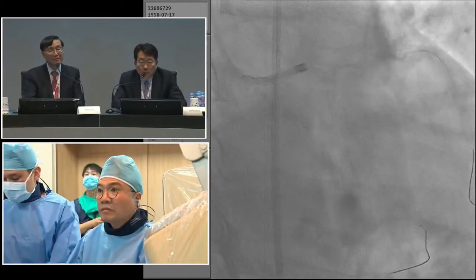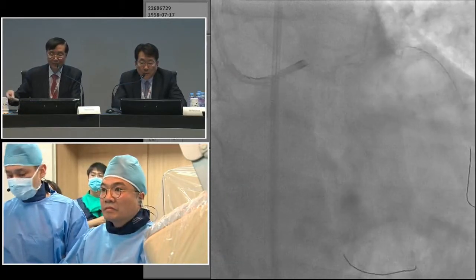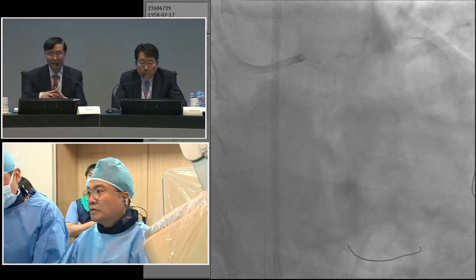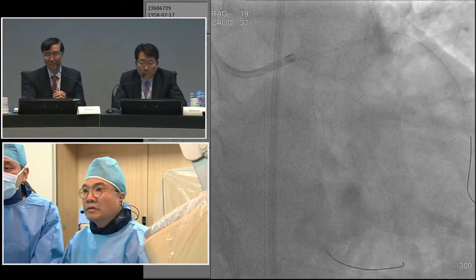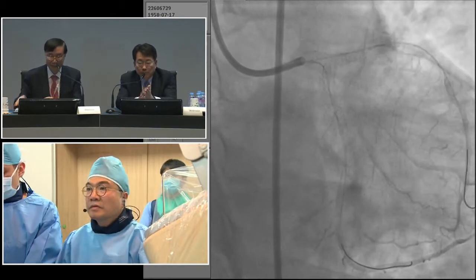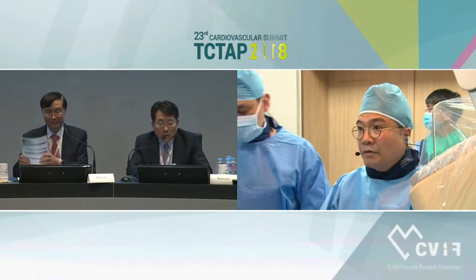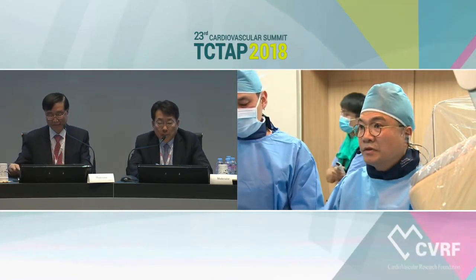Okay, so all right, final. Perfect. Okay. Beautiful. So I think I will do some IVUS examination.